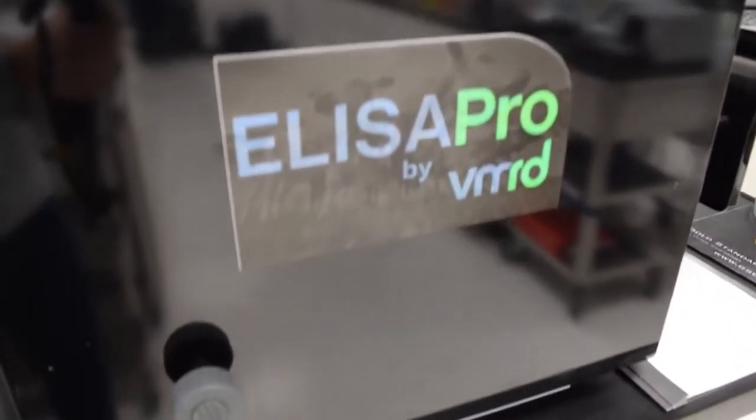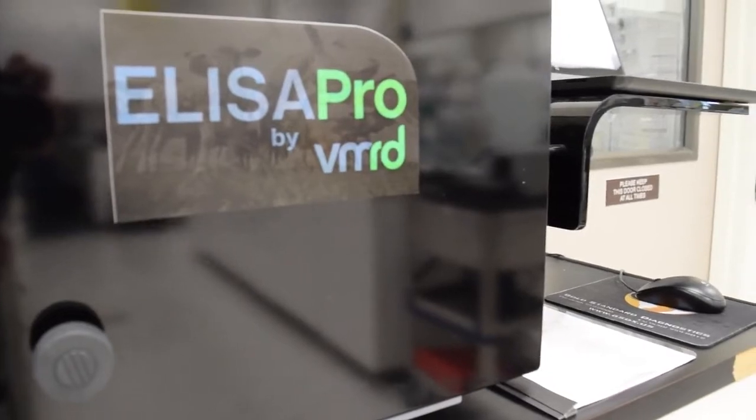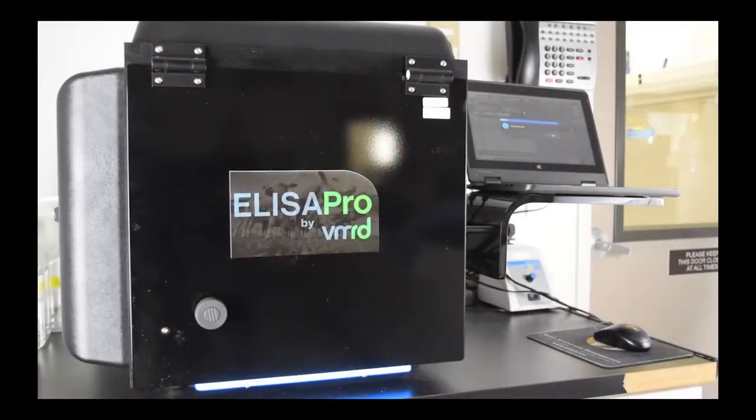We are pleased to introduce the ELISA Pro assay processor. It is fully automated to run your VMRD assay from start to finish, providing consistency between runs and saving valuable personnel time for other laboratory efforts.